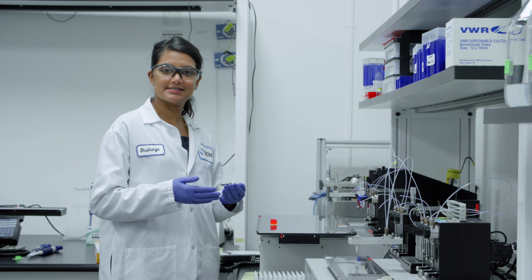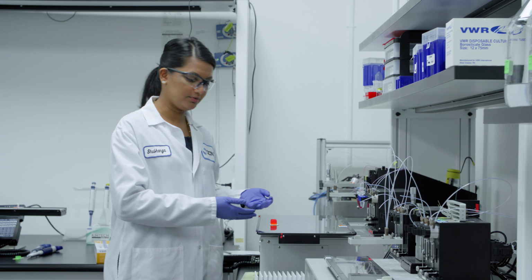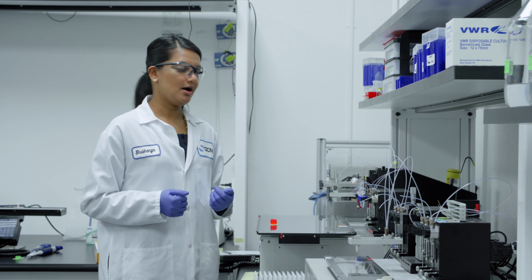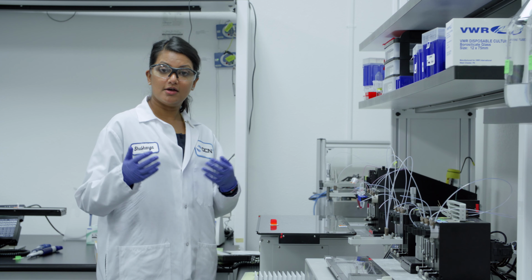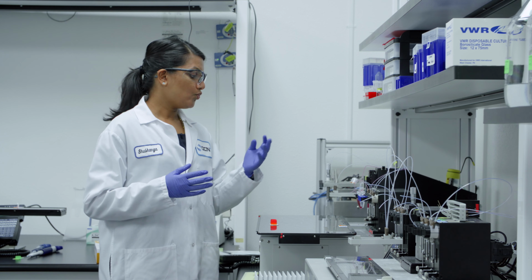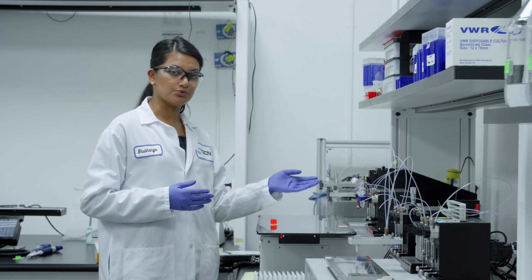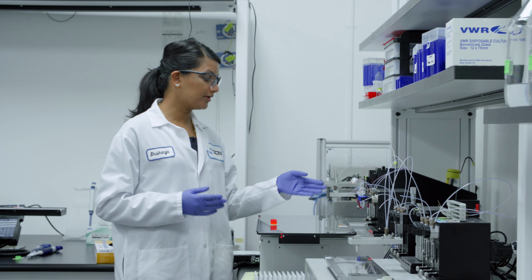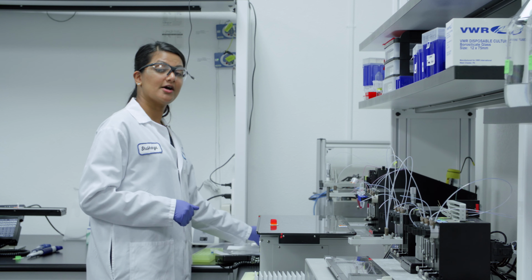When we stripe on the test line, we can't really see the antibody other than initially when you dispense. So in order to visualize whether 2 antibodies bound to an antigen, we need one of the antibodies to be labeled to a visual particle. And this visual particle will dry down and dispense into what we call a conjugate pad.